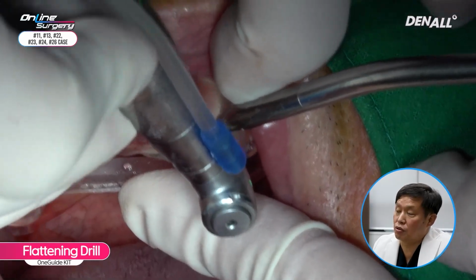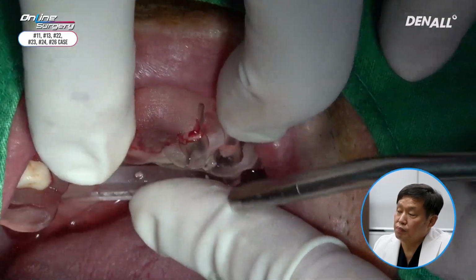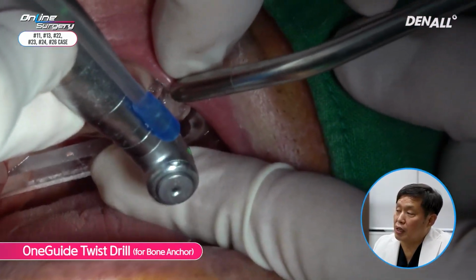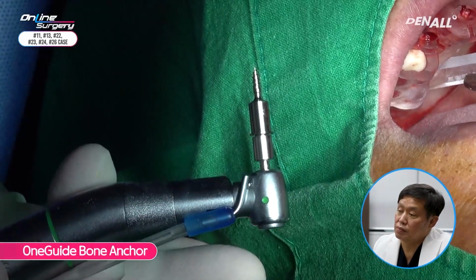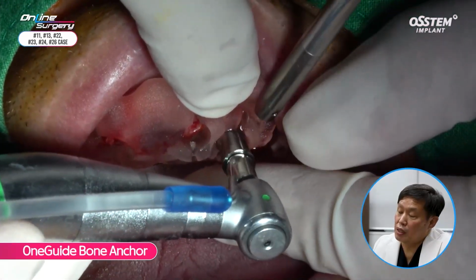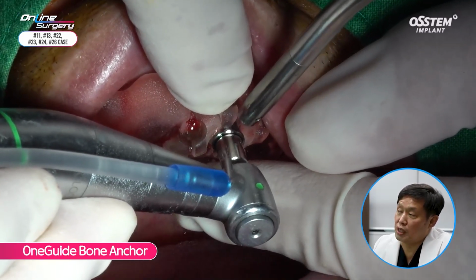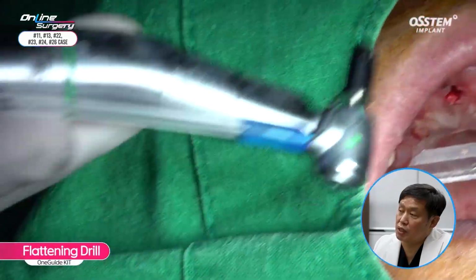In number 23, the flattening drill was used at full length. Then a twisted drill was used to place vertical anchors. Vertical anchors were fixated. Bone anchors were used. In number 23, the patient's left side is all distal free end, so sure fixation is necessary. This is essential in preventing any deviations in the anterior zone.